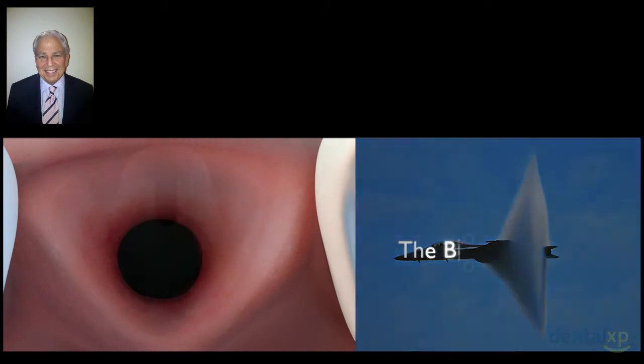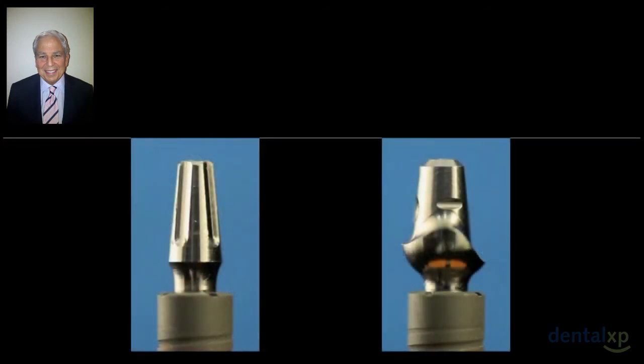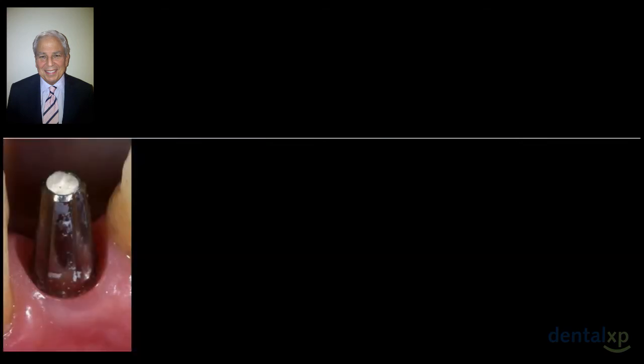So when he takes a look at this, and then we talk about putting the abutment in there, and that's also going to be surrounded perfectly with the soft tissue, he entitled this, and this is his term, the biologic envelope. So let's see how the abutment selection is going to be affected by this biologic envelope. We have a convergent abutment over here, and we also have a beautiful anatomic abutment over here. Now we're dealing with a space. This happens to be tooth number 23.